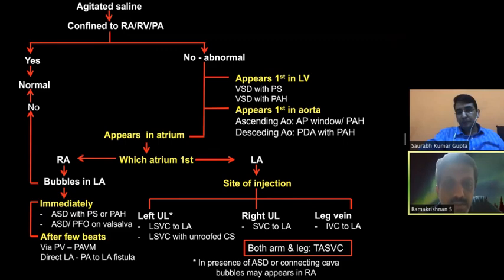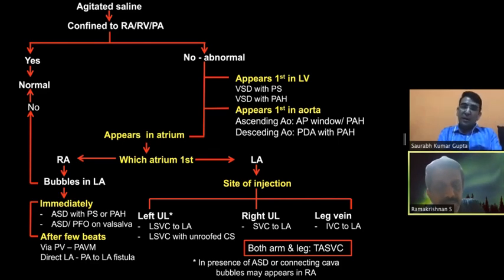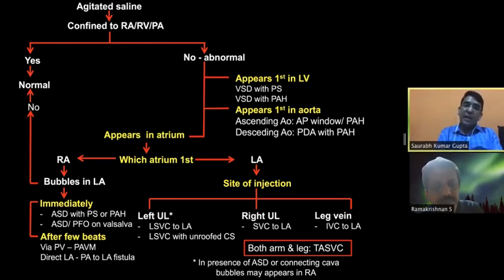One more question that has come up is: explain the correct method of diagnosing PFO in stroke in young by contrast echocardiography. That is a chapter in itself, but briefly, it's very, very important that we do a provocative maneuver, because without that, almost 50% of the tests which are going to come positive become negative.